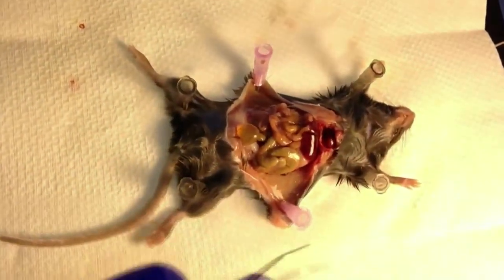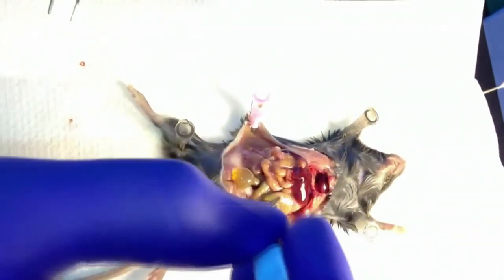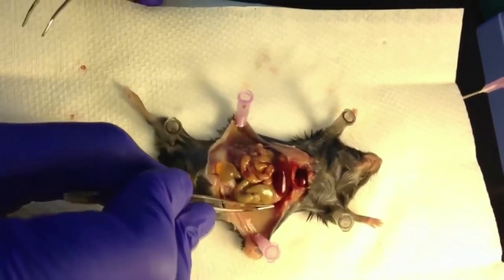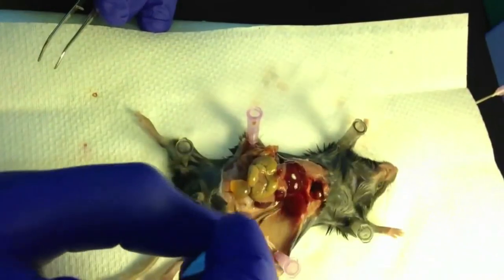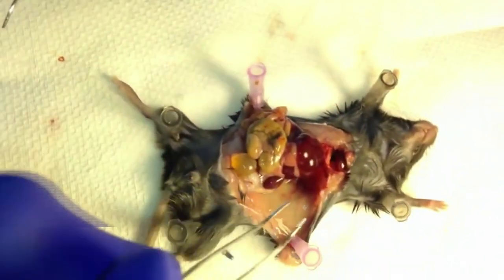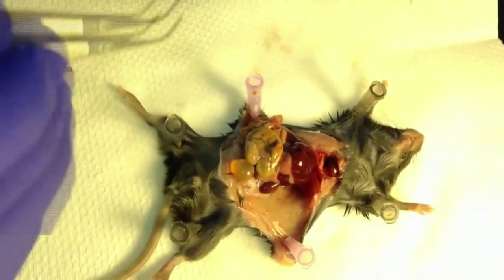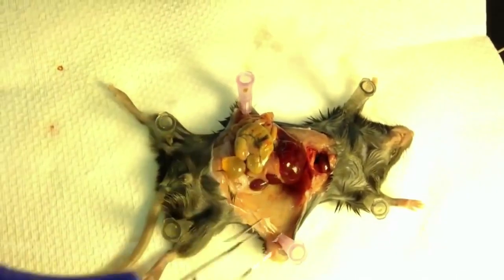Okay, so now you see the general area that we want to work with. So this is the liver here, this is the intestines. And so what you want to do is move this all to the left, and this exposes here the liver, here's the spleen in between, and then here is the kidney. It could be a little bit difficult to tell between the three, but the spleen should be in the middle, and it should be long and kind of solid as opposed to the liver, which is very squishy.